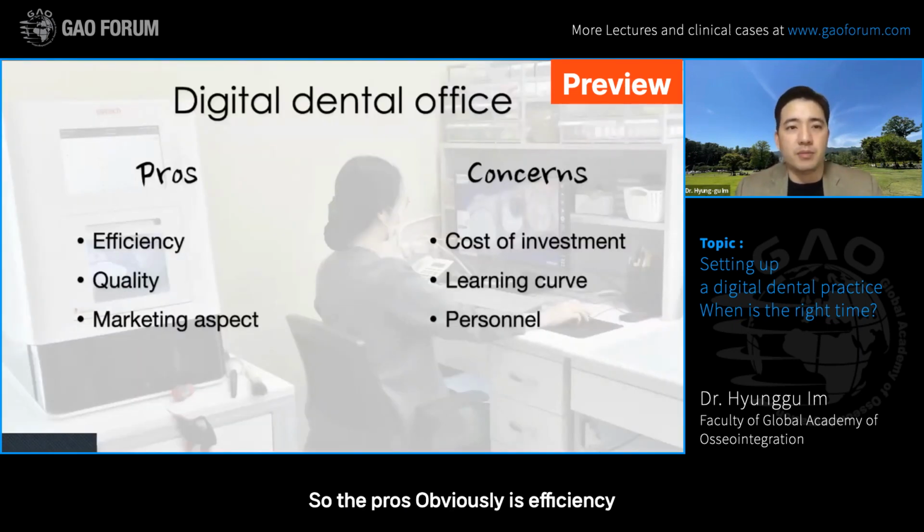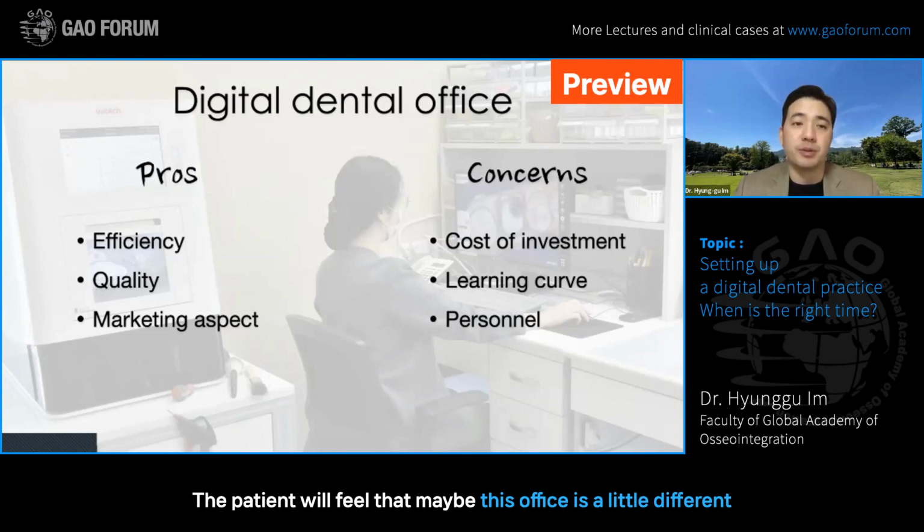The pros, obviously, is efficiency. We don't have to make the conventional impression, wait for it to set, and send it out to the lab that will be pouring the stone. Patients will feel that maybe this office is a little different.